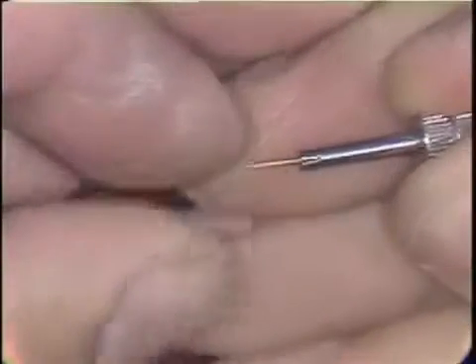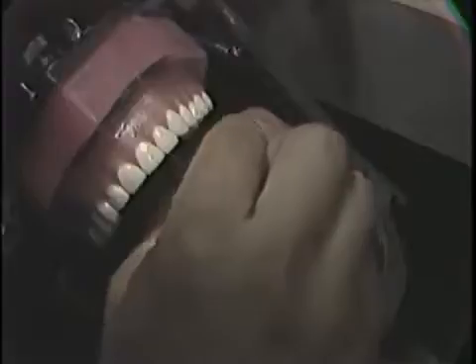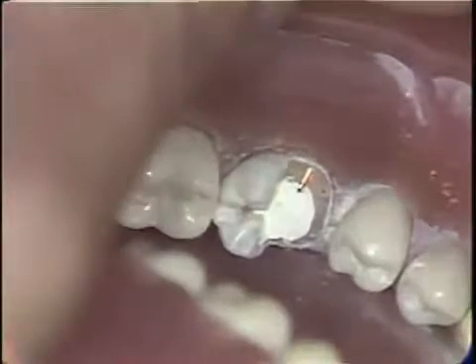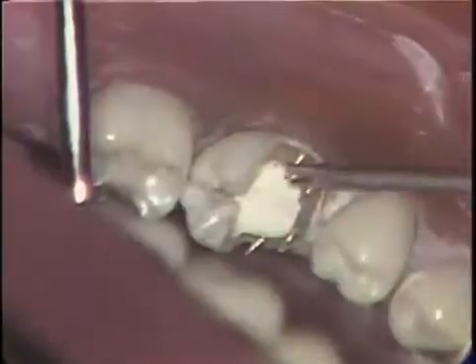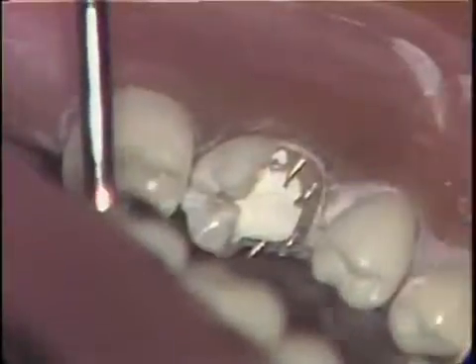The TMS pin is placed into the wrench and the pin is inserted into the tooth. When the pin resists further turning into the tooth, it is fully seated. Place the next pin into the tooth. These are tiny pins and sometimes it's difficult to manipulate them in the mouth. Once all four pins are in the tooth, use the TMS bending tool to bend the pins in toward the center of the tooth so that when the amalgam is placed the pins are confined within the amalgam.